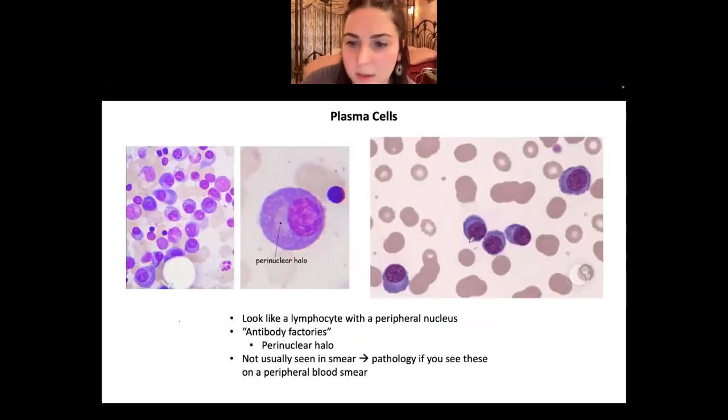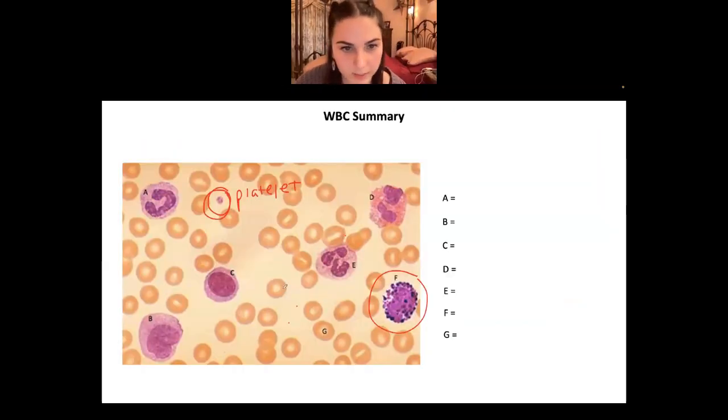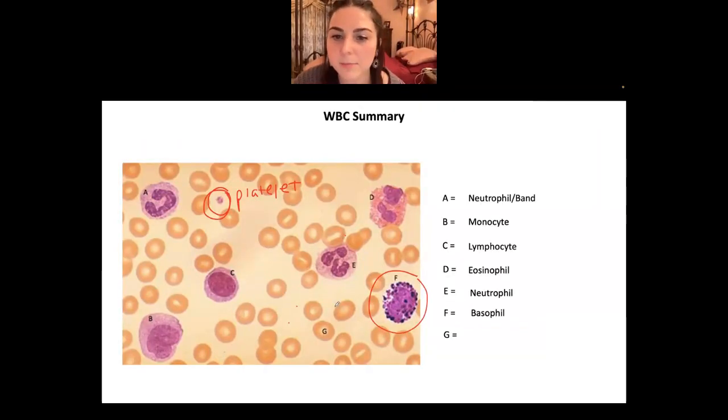And then a couple people actually said plasma cell, which I get because it's pretty much the same size as your red cells, but those are going to stain purple. They're going to look more like lymphocytes versus your red cells, which aren't going to stain purple. They're just going to kind of be there. These are what your red cells look like, erythrocytes. Everything you guys said was perfect. Okay, makes sense. If you can identify these, you probably will be in good shape.